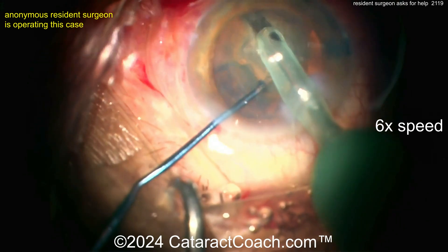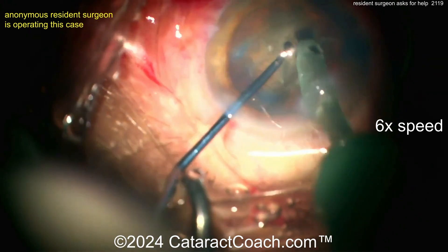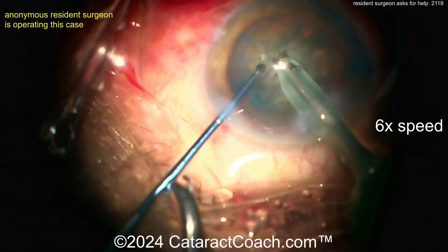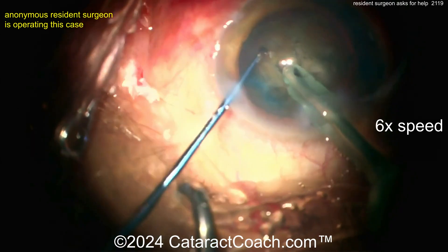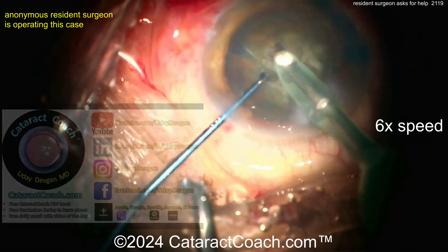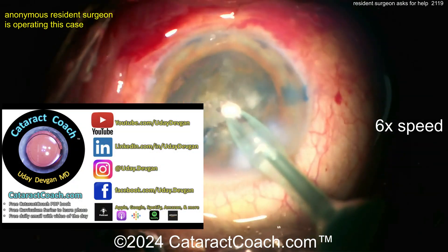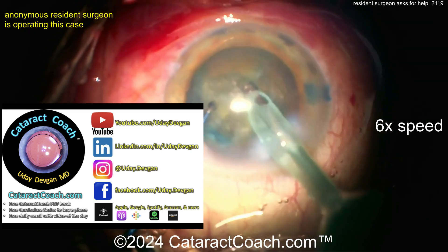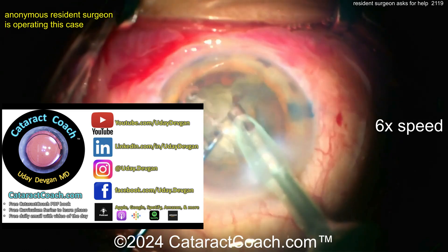Now look at the eye falling off our field here. You might say your view in the microscope is bigger, but still look at the round area of illumination — you're not in the center of it at all. And you think I'm nitpicking, but that's actually a big deal. I would bet this young doctor that you have not seen the CataractCoach.com website, you have not downloaded the free PDF book, and you have not gone through the full 25-part curriculum series — there's just no chance. Because otherwise we wouldn't be seeing a lot of these issues.